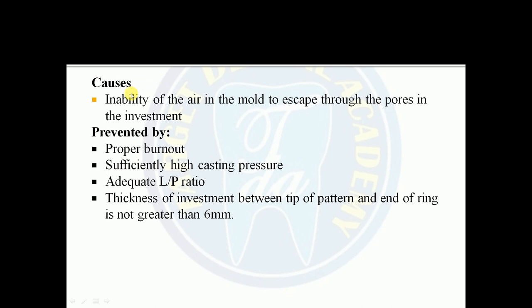Causes in this: the inability of air in the mold to escape through the pores in the investment. It can be prevented by proper burnout, sufficiently high casting pressure, adequate liquid powder ratio, and the thickness of the investment between the tip of the pattern and the end of the ring not being greater than 6 mm.